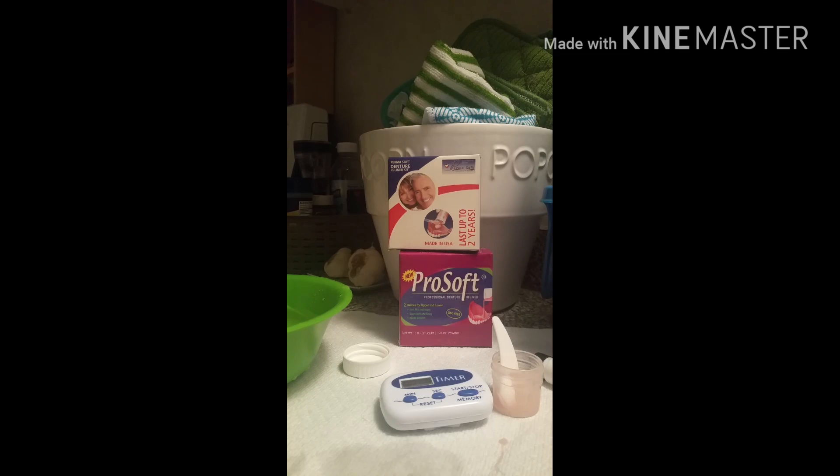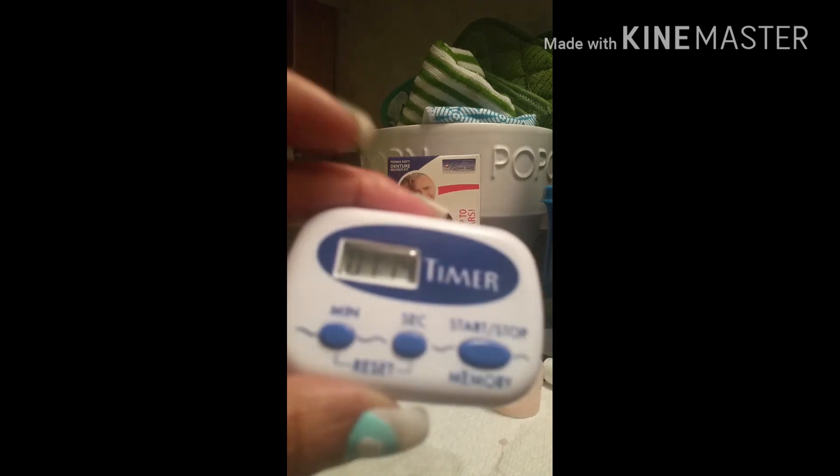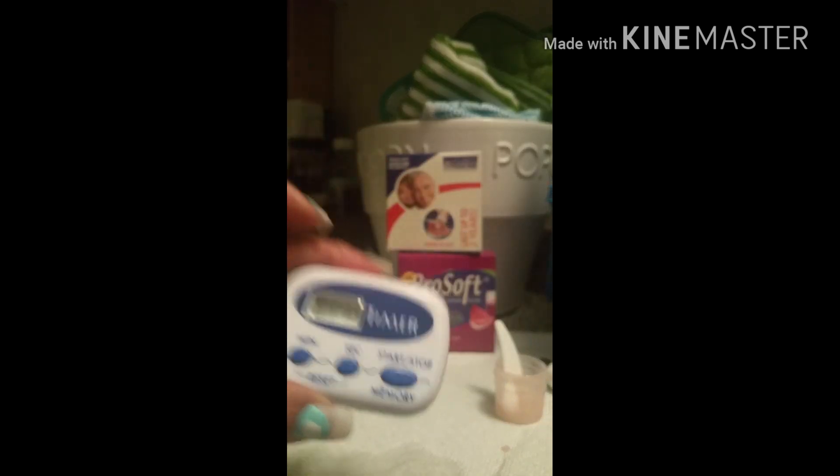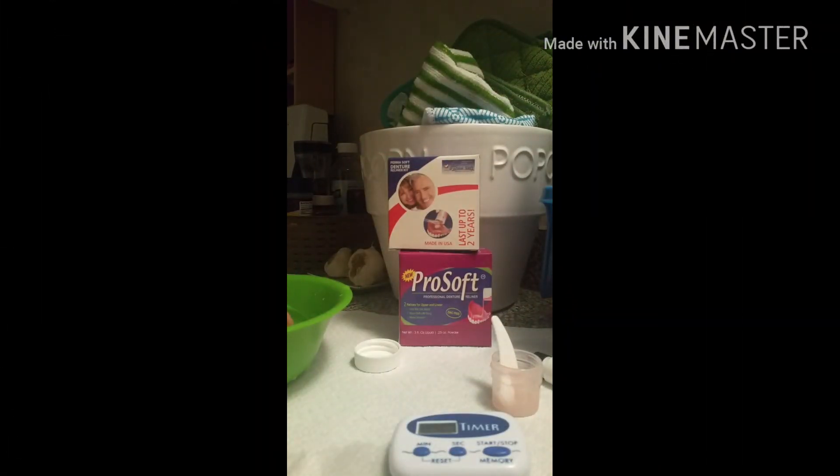Three minutes are up! I still have that taste in my mouth — it's not a bad taste at all. Alright, we are done soaking in the cold water. Now I need to trim it.